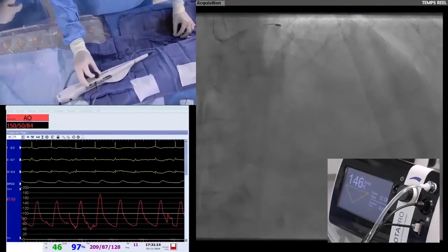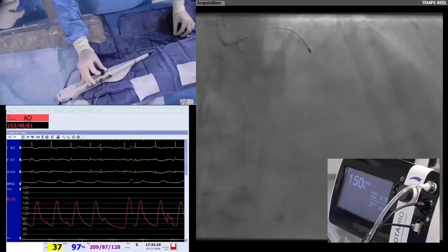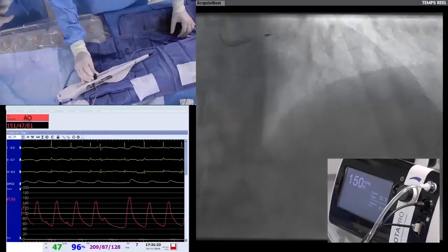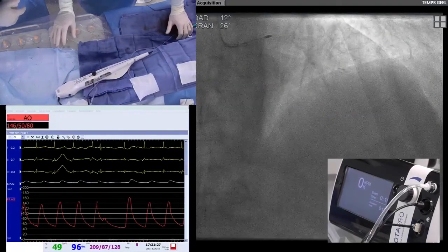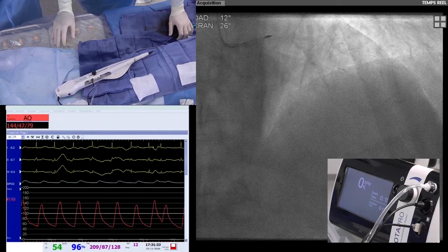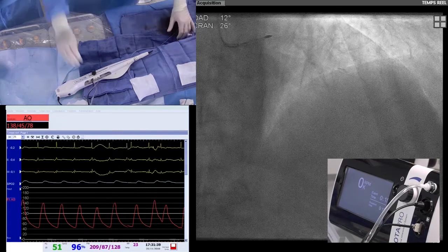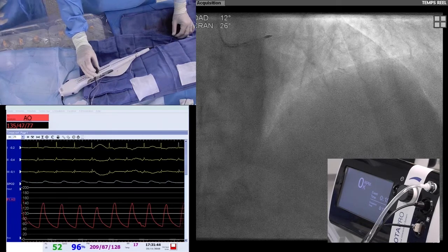In the ostial part, I don't feel any friction. In the proximal LAD, there is friction. Okay, I wait. There is no friction, so I can keep the burr inside the left main. And let me share with the colleagues these tips. There is this nice gentleman at my right who's informing Nicolas about the duration of the run, and he shouts when we pass 10 seconds. That's a very nice trick that I wanted to disclose from the cath lab.